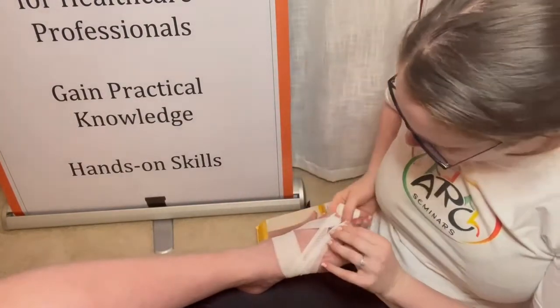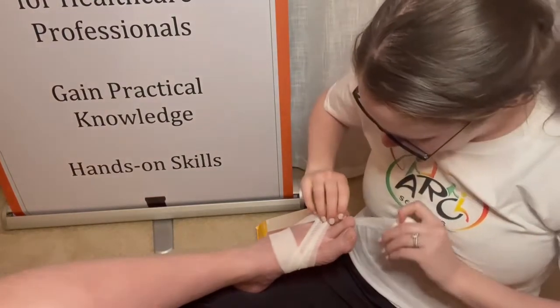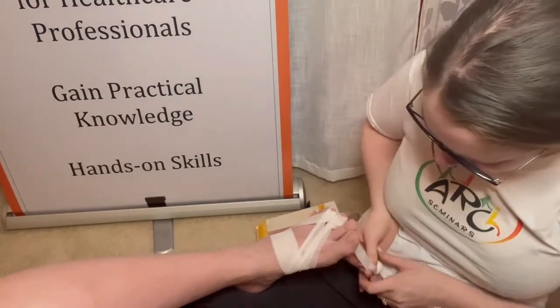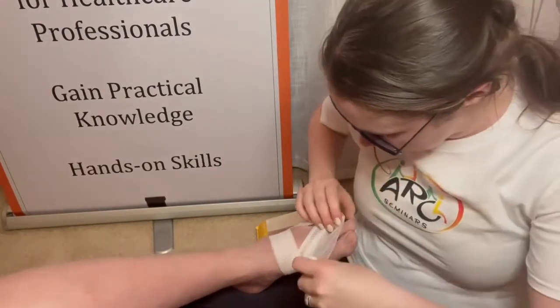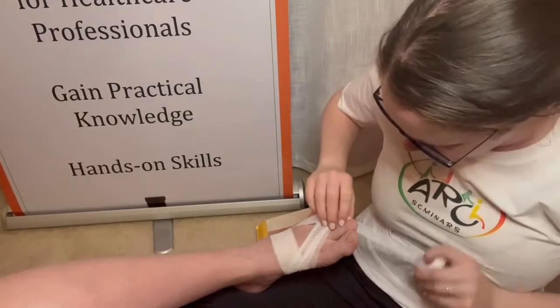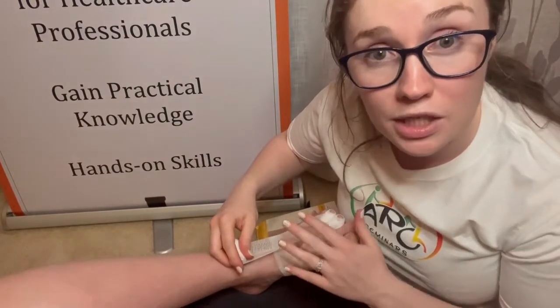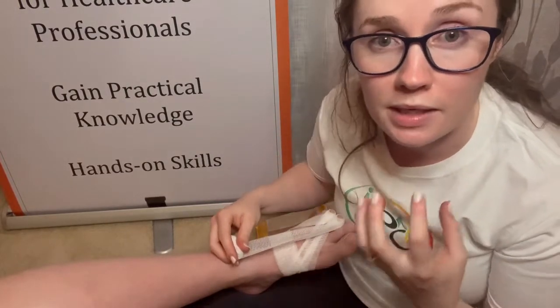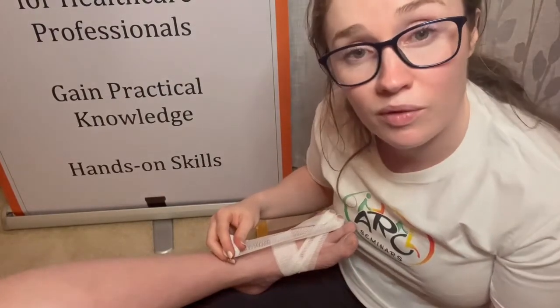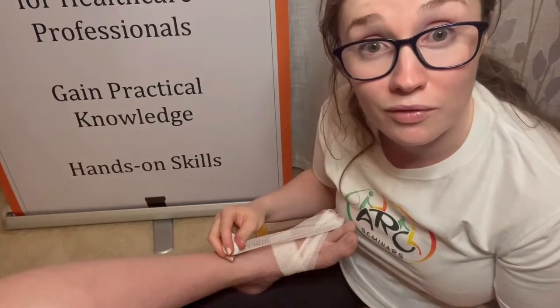As I was saying, toe bandaging is not always necessary and it's not always feasible depending on the setting you work in. However, if your patient has fibrotic toes, if they have squared off toes, which is very common with lymphedema, and especially if they have a fungal infection, bandaging is something that's really important to do because it'll help your patient's toes get softer, it'll help the swelling come down, and in the case of a fungal infection, it'll help them from reinfecting the skin around the toes and the rest of the foot.